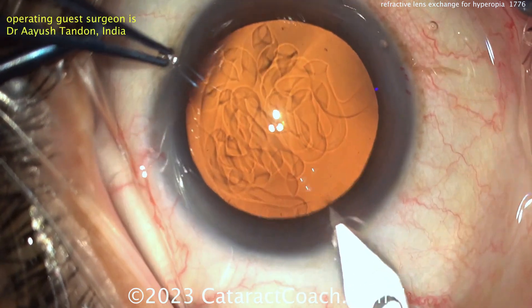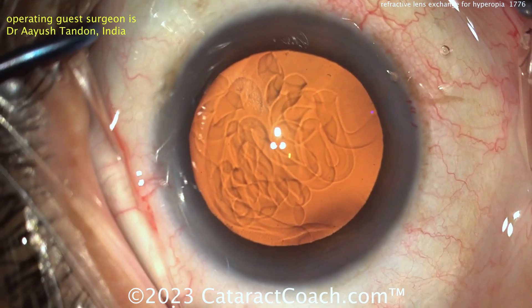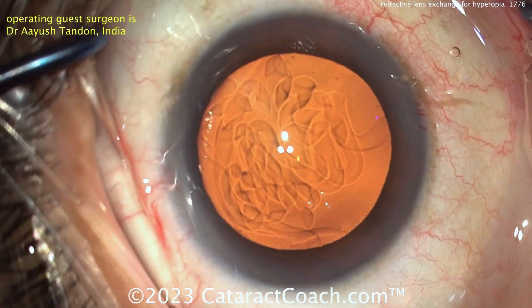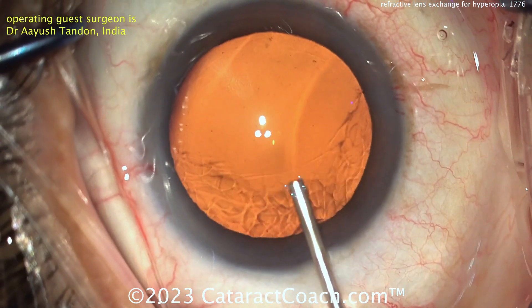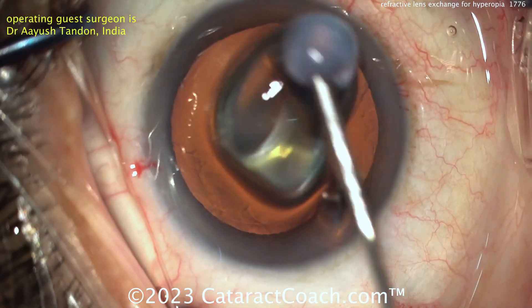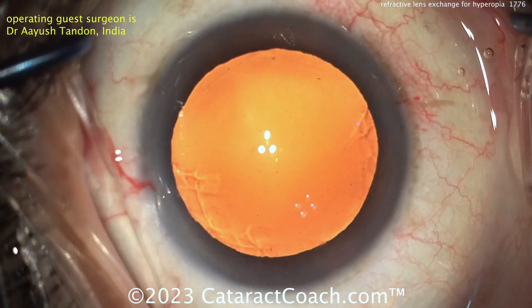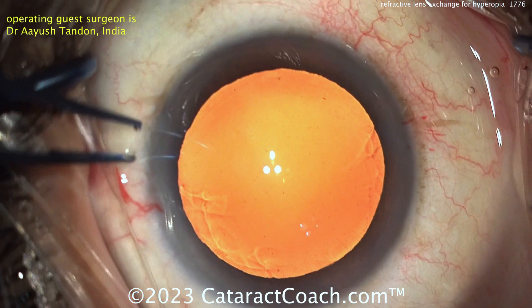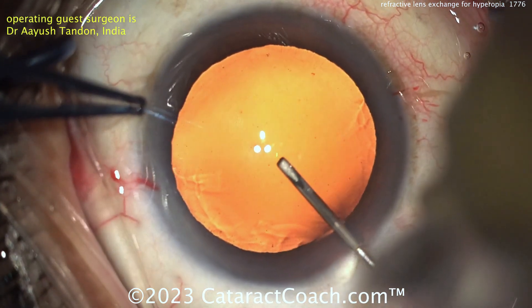Here comes the main incision — a nice single-plane incision, loosely filling the anterior chamber with viscoelastic. There's the dispersive viscoelastic; looks like HPMC, hydroxypropyl methylcellulose, very commonly used outside the U.S. It's a very easy one, doesn't require refrigeration, and it's relatively inexpensive.